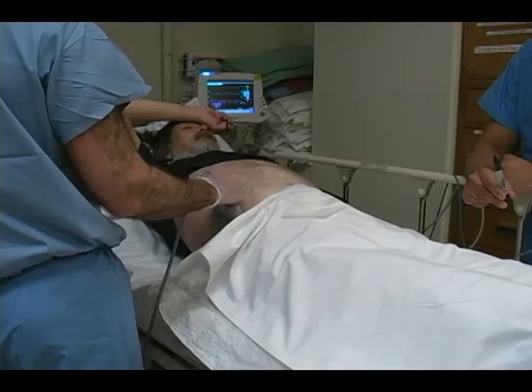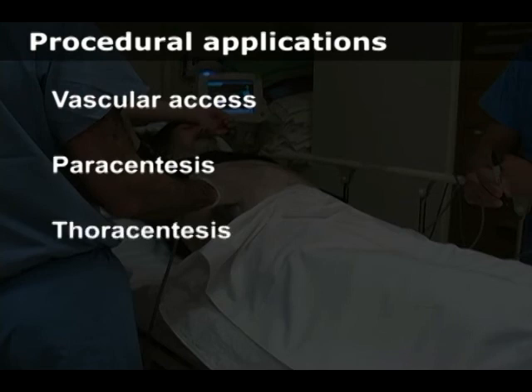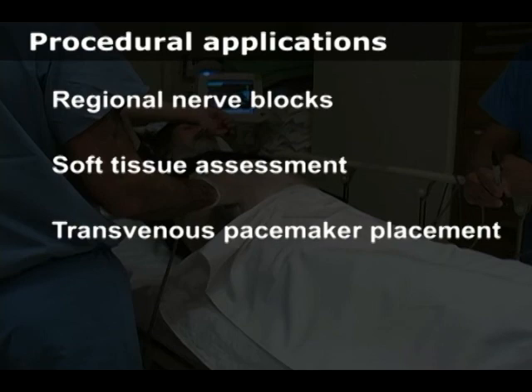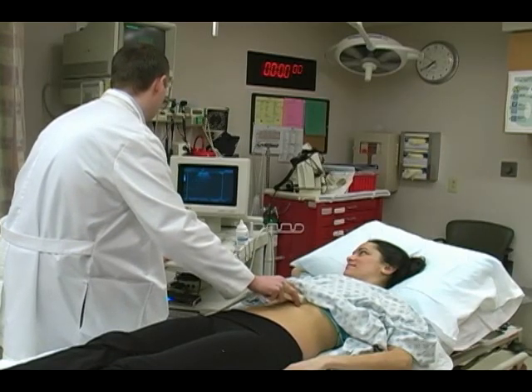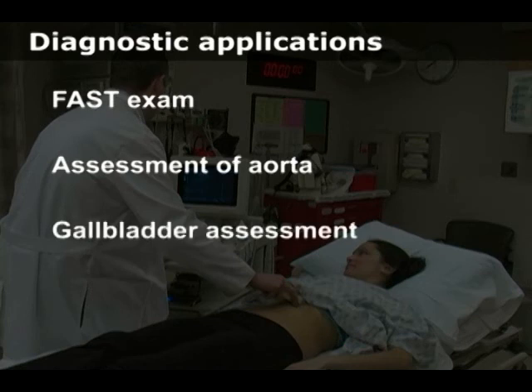Procedural applications include ultrasound-guided vascular access, both central and peripheral access, paracentesis, thoracentesis, lumbar puncture, regional nerve blocks, soft tissue assessment for abscess, transvenous pacemaker placement.